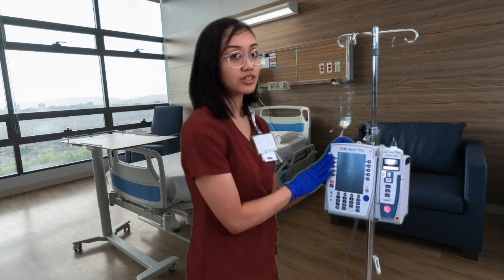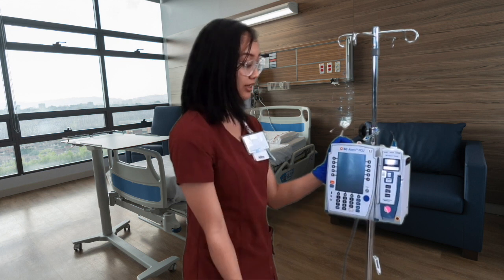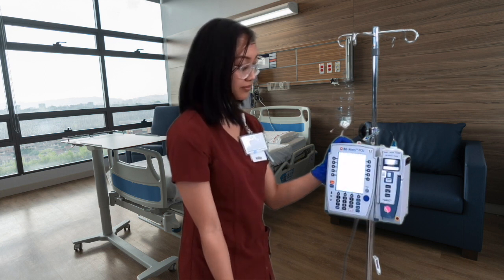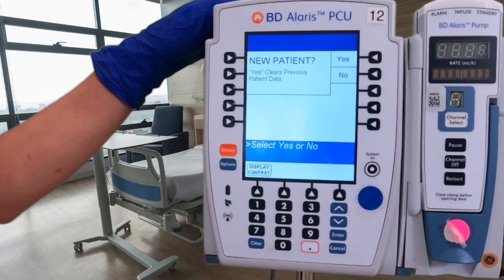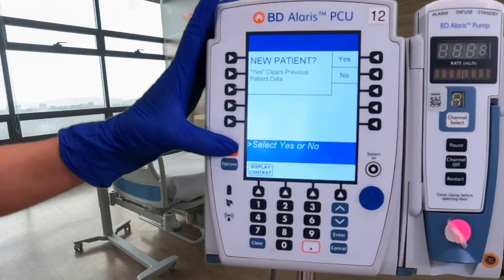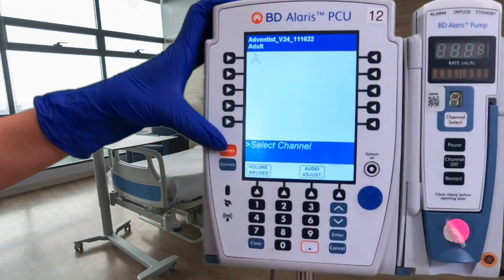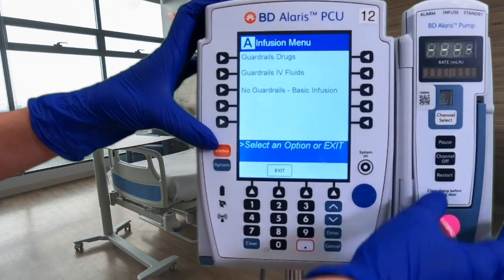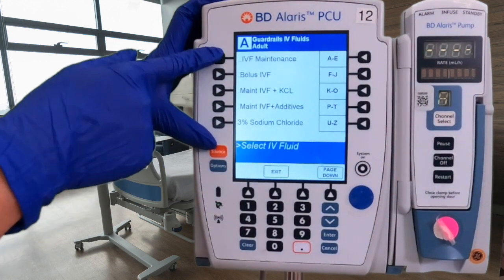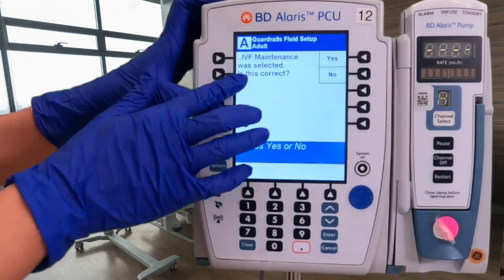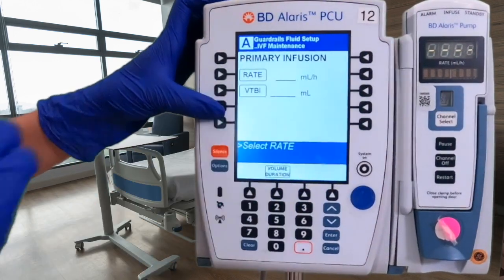Now that our line is connected to the pump, we can start programming. Turn the system on by clicking the power button once. Let's say our doctor ordered 125 mL/hr for a liter bag. This is a new patient, so press yes; they are an adult, so press yes again. Press channel select — since we have sodium chloride, we'll press Guardrails IV Fluids. This is IV maintenance, so click that and confirm yes.